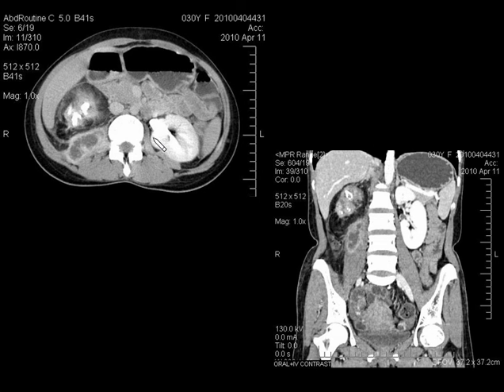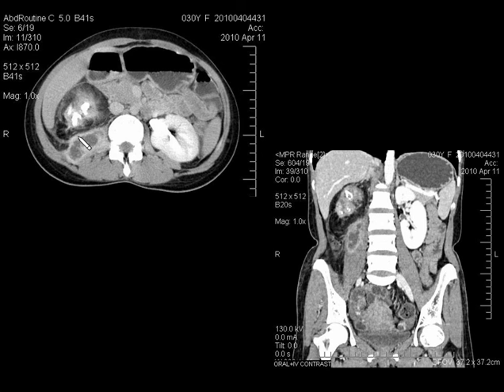Coming to the next spotter, you can see multiple calcifications in the right kidney with fatty replacement of the renal parenchyma, perinephric fat stranding, and a hypoenhancing collection in the right psoas muscle with peripheral enhancement. This is a classical case of xanthogranulomatous pyelonephritis with right psoas abscess.